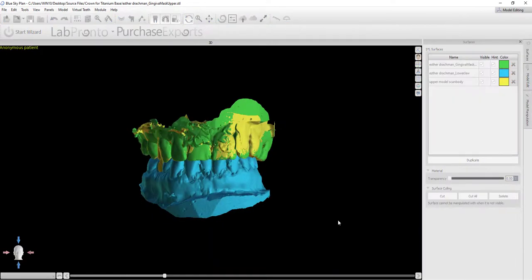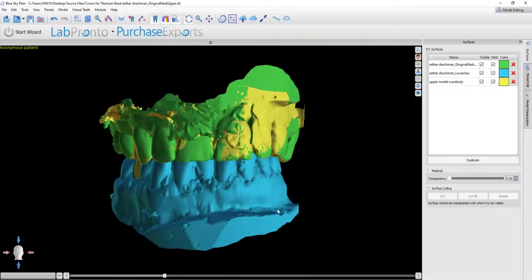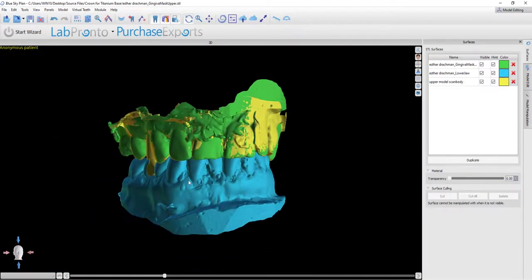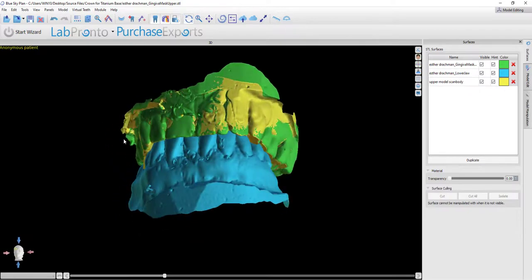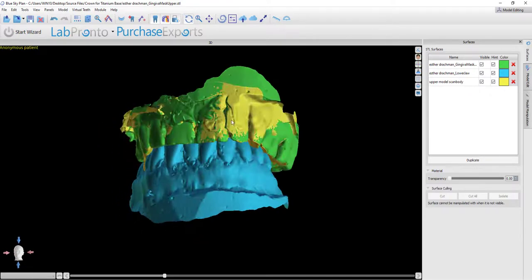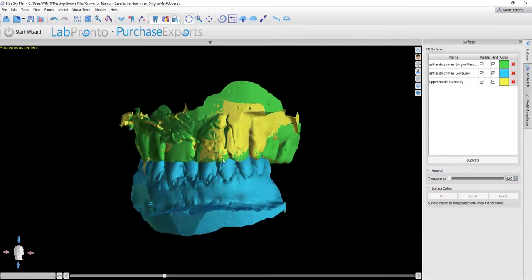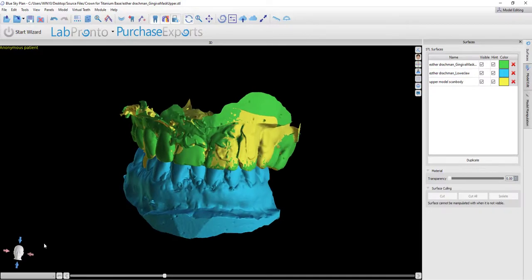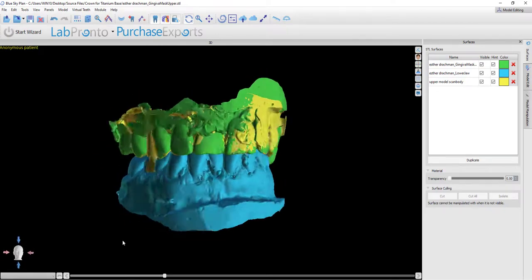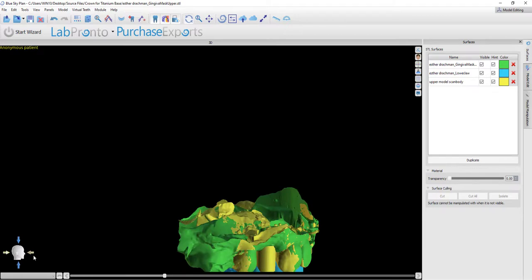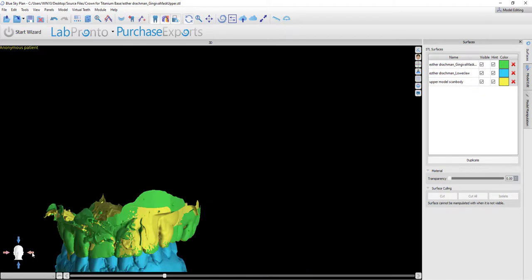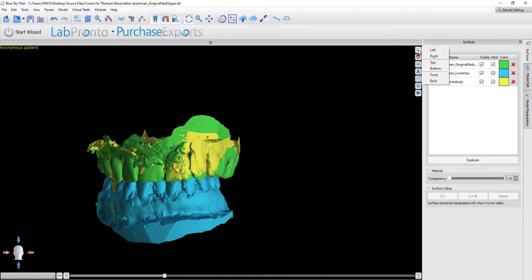Click Finish, and the models have been imported into the software. And we can see that with the processes outlined, the model orientation in the 3D view match the head in the bottom left of the screen. The models can be rotated with the left mouse button by grabbing and dragging, by clicking on the arrows in the bottom left next to the head, as well as by using the top button to change view angle.